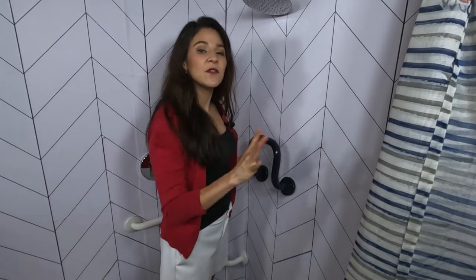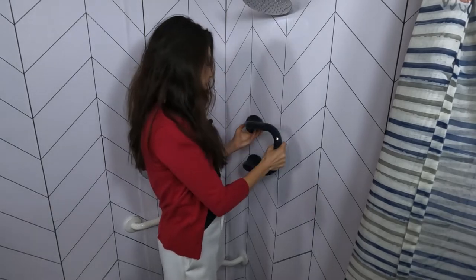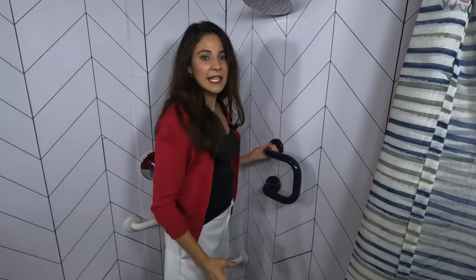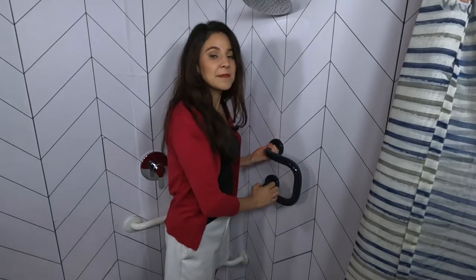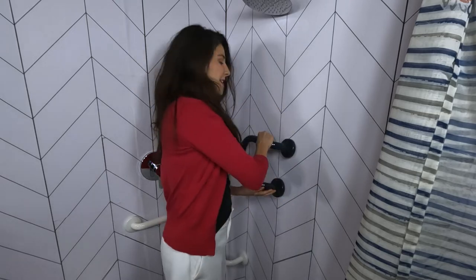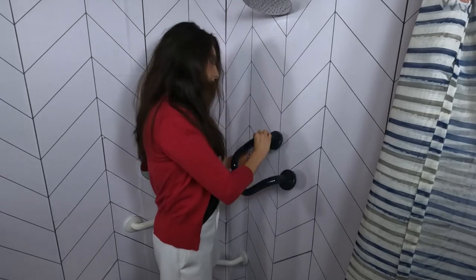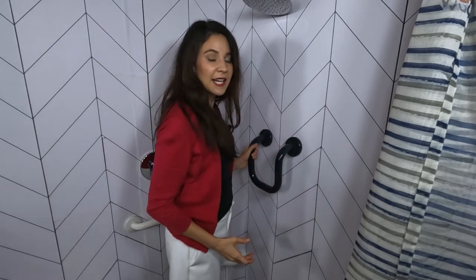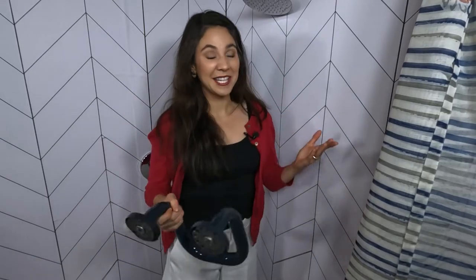I also like that if this grip didn't work for me, I could flip the grab bar so I could grip it on the top. I could flip it the other way and do the exact same thing, or flip it this way and hold onto it with both hands side to side. There are so many options for how you can install this in your shower. Let's go see where else I could put this in my house.